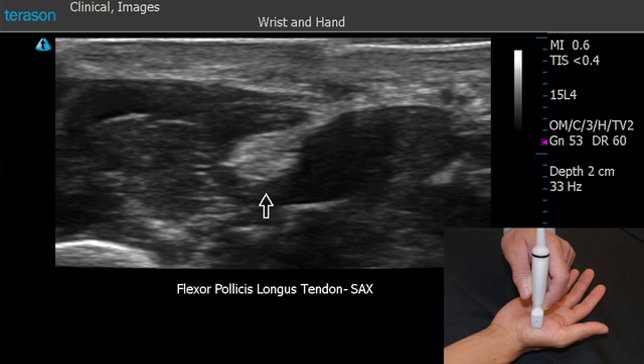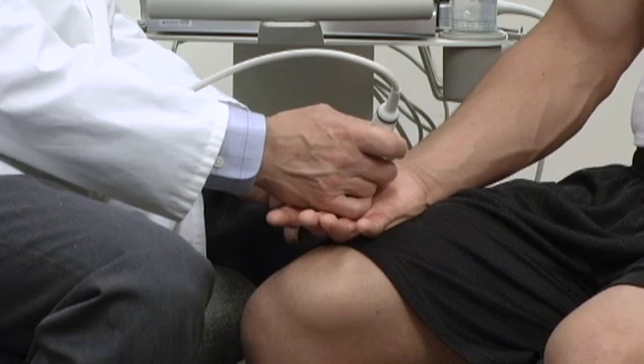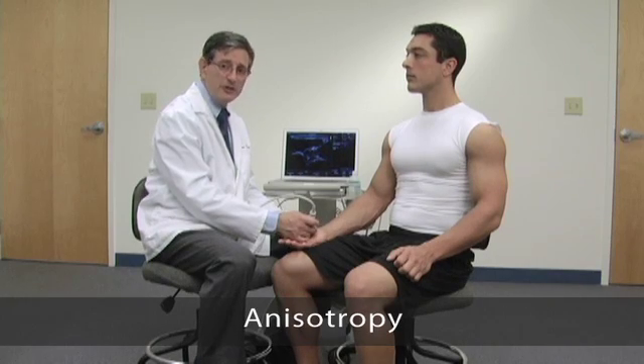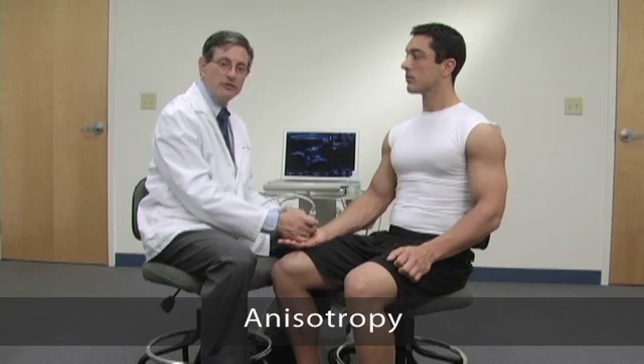Now, as mentioned earlier, holding the probe is very important, and there are a couple of tricks you're going to need to learn when performing musculoskeletal ultrasound, because one of the most common artifacts is something called anisotropy. Anisotropy simply means that if we tilt the probe in one direction or another, the tissues will become brighter or darker. Certain tissues have a very strong anisotropic effect — tendons, notably, have the strongest anisotropic effect.